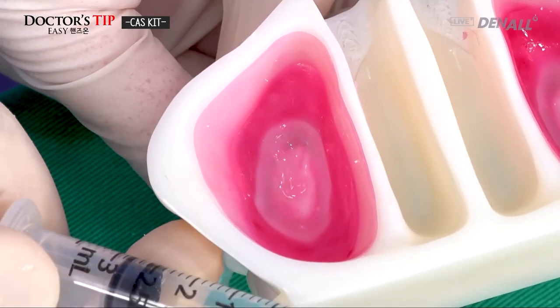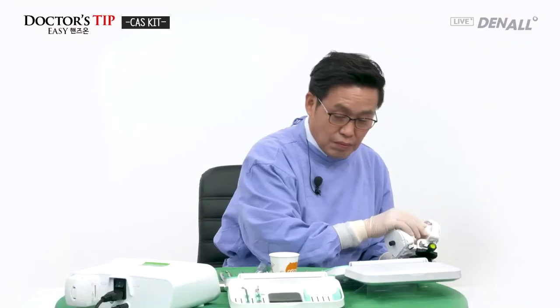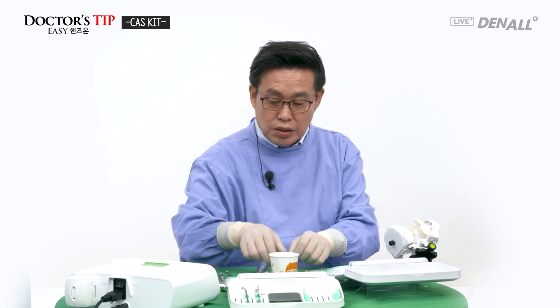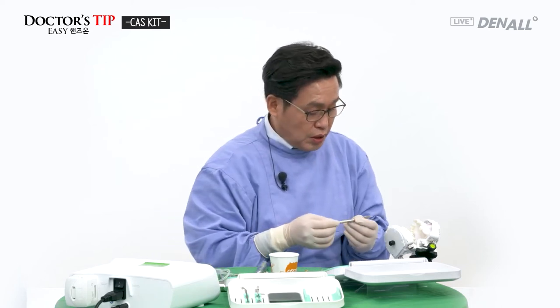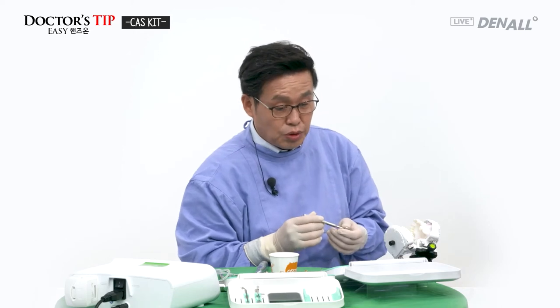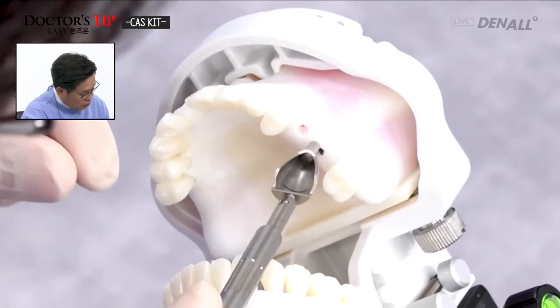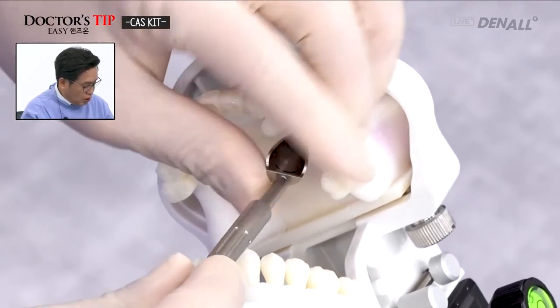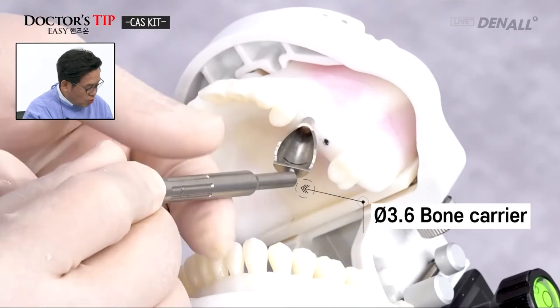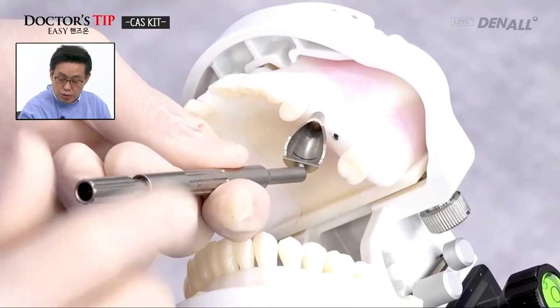The sinus membrane is being elevated. Hydraulic elevation is finished. Now it's time to do the bone grafting. The final drill was 3.6. This bone carrier is inserted into the hole, and from the back we can adjust the angle into the bone carrier.